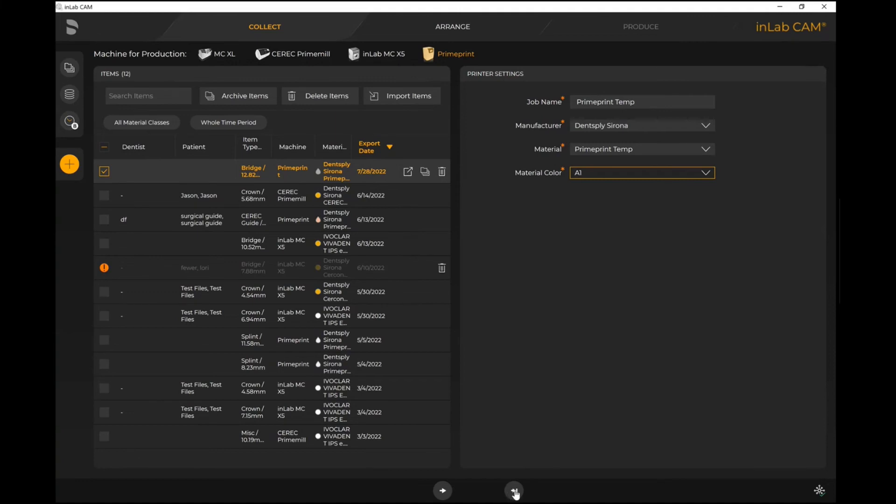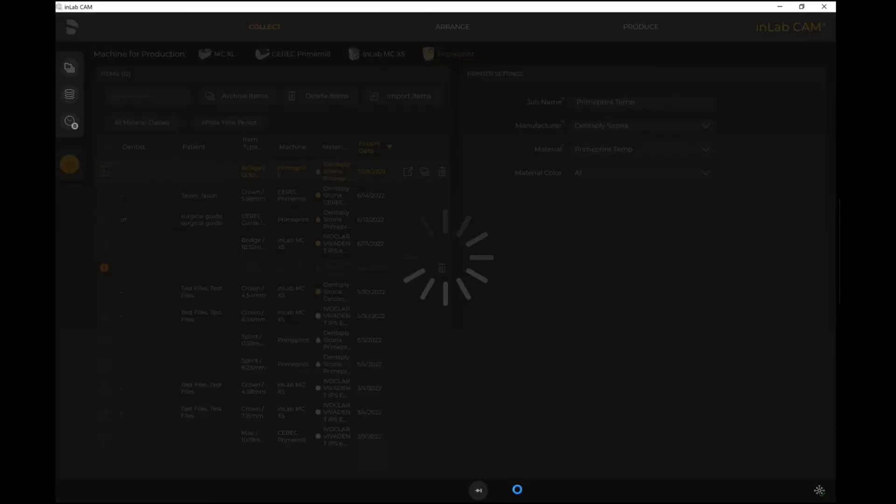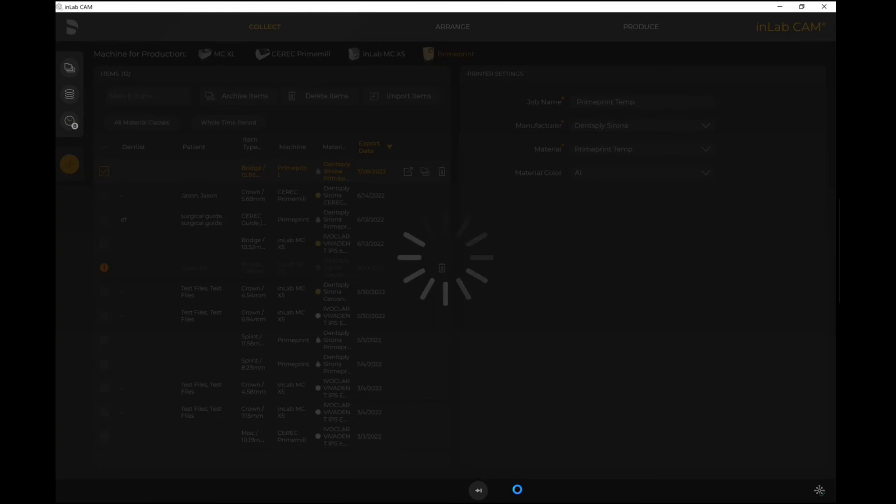However, if I want to proceed forward with the Fast Forward option, obviously the system is doing a lot more of the automation for me and optimizing the way it's actually positioned on the build tray. Then I'm able to proceed forward as such. But this has essentially been the workflow of how you import an STL file.